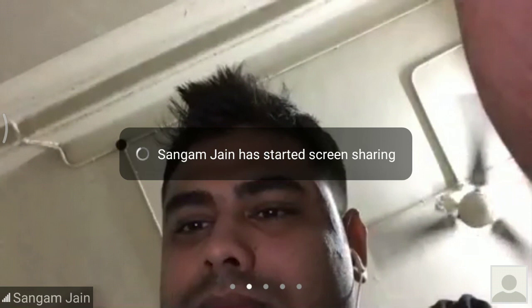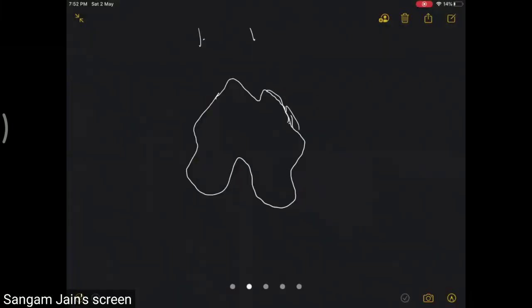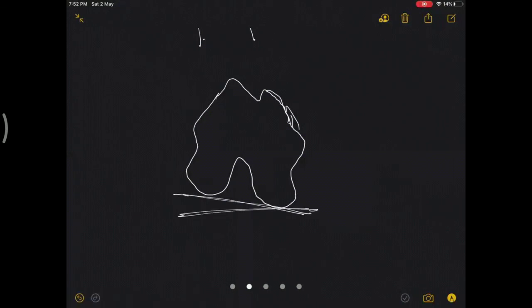So the thing is you have a posterior condylar axis which is 3-degree internally rotated, so you will have to dial it to a 3-degree external rotation, so that you have the proximal tibial cut like this, so you will have to align it to the transepicondylar axis.